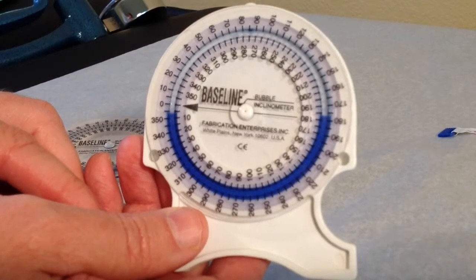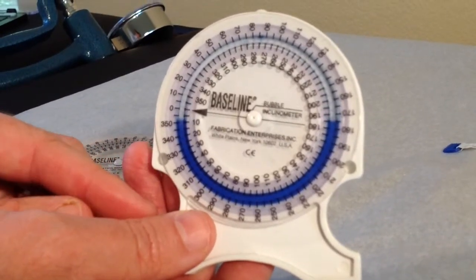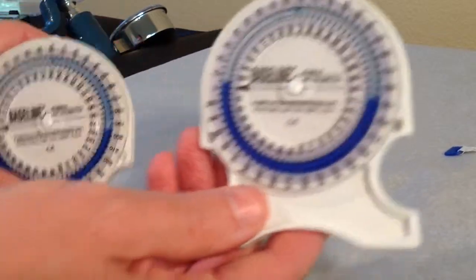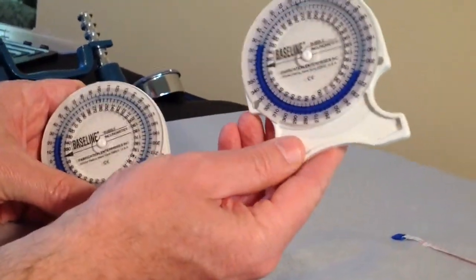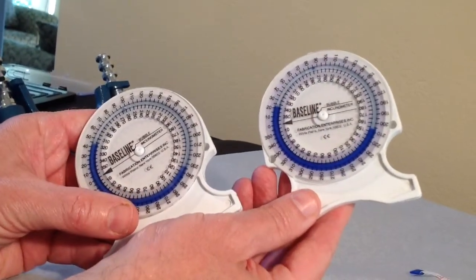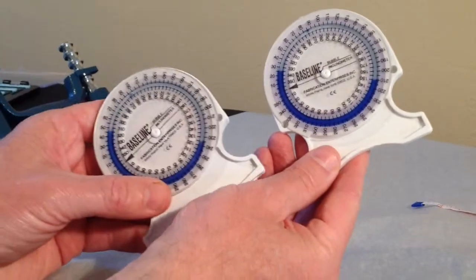Inclinometers are used primarily for measuring spine motion. They are placed in tandem in a pair. One inclinometer is placed at the top of the spine level being measured, the second inclinometer at the bottom, and the bottom measurement is subtracted from the top measurement to obtain the measurement angle.